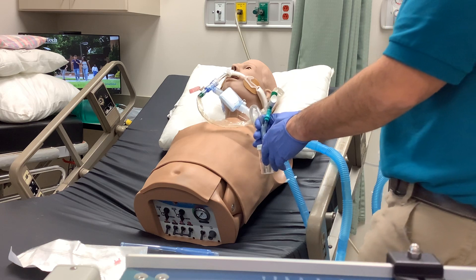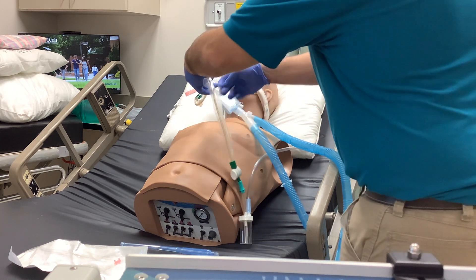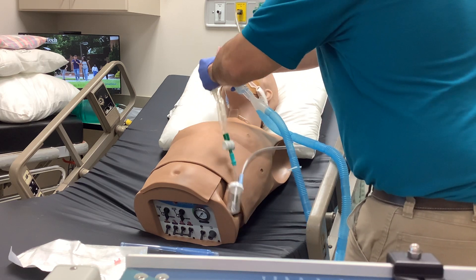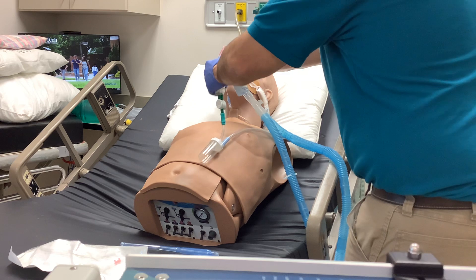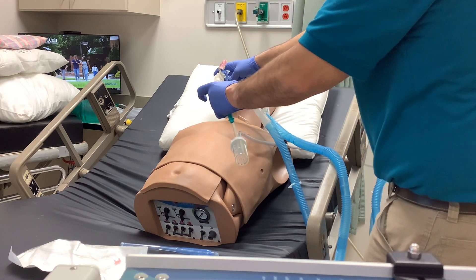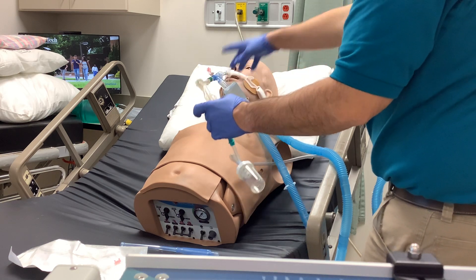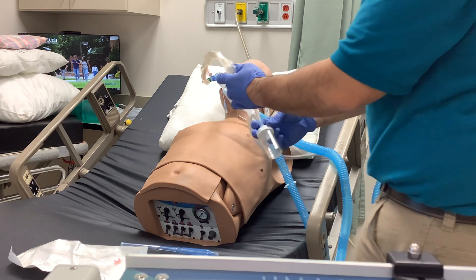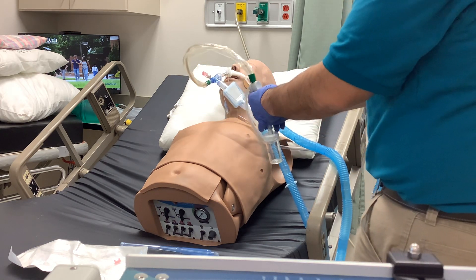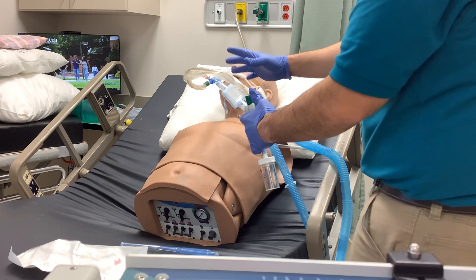Keep this as upright as you can when you go through and do your suction procedure. Tell the patient — we're going to ask them to cough. Big cough. You go down, you meet your resistance, you come back. You'll feel your suction. Now your sample, as opposed to being pulled back to the canister on the wall, is going to go inside of this Lukens trap canister. Once you feel relatively satisfied with what you've got, note that there will be secretions left in the catheter as well.